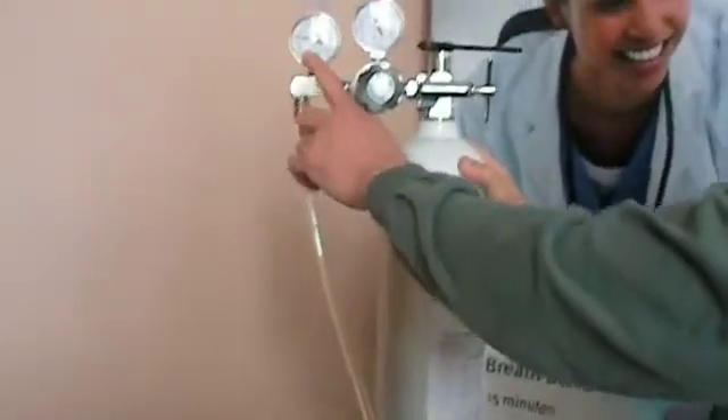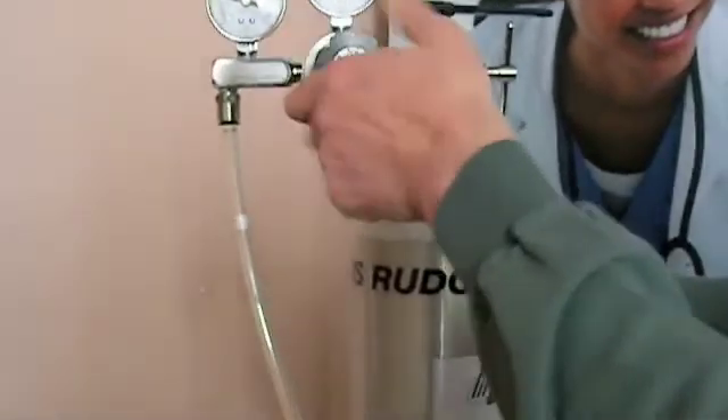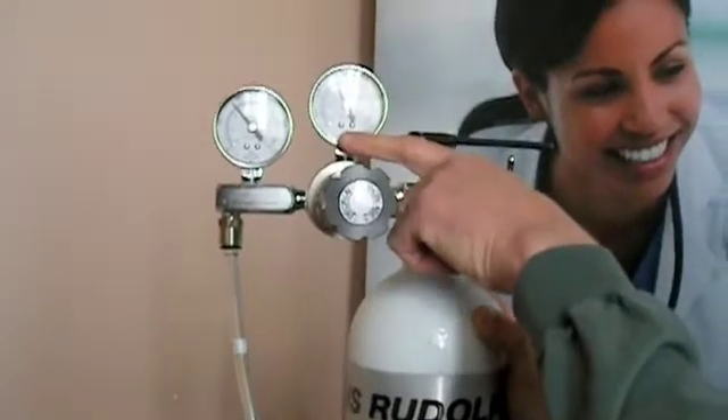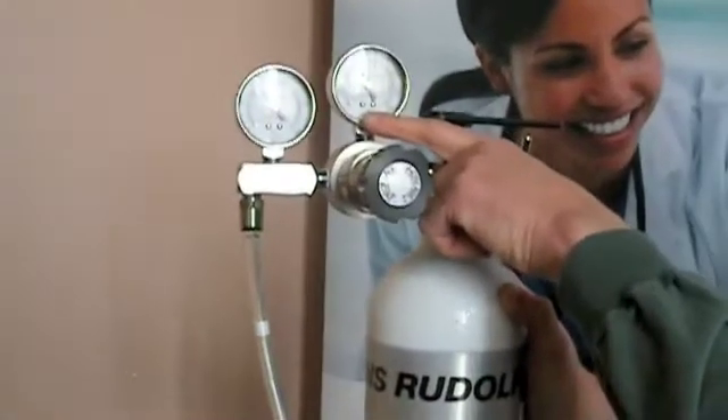Then adjust the regulated pressure to 70 PSI. Ensure that the bottle pressure is greater than 500 PSI.